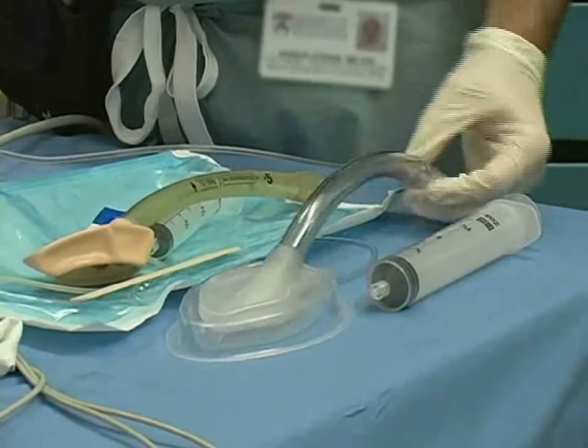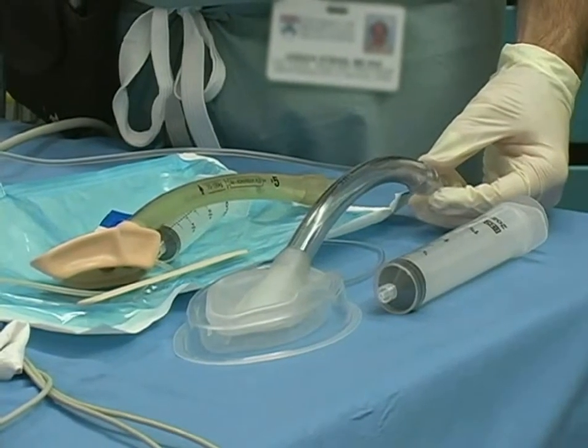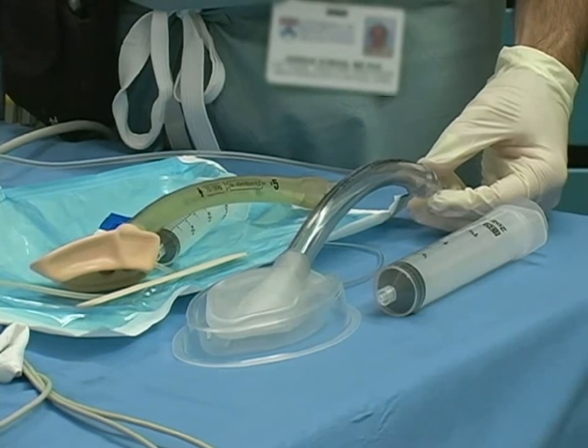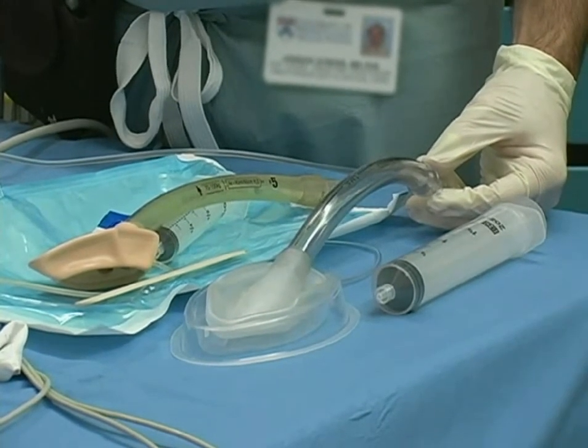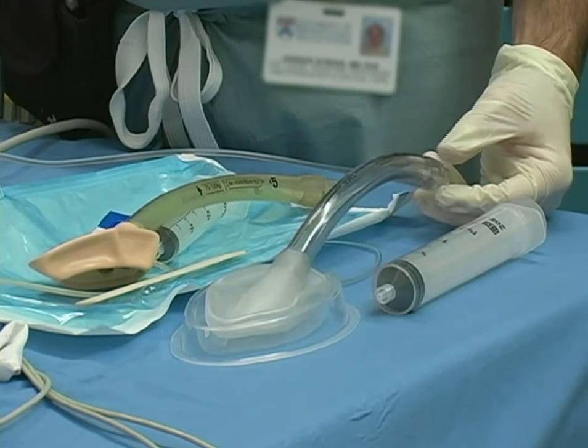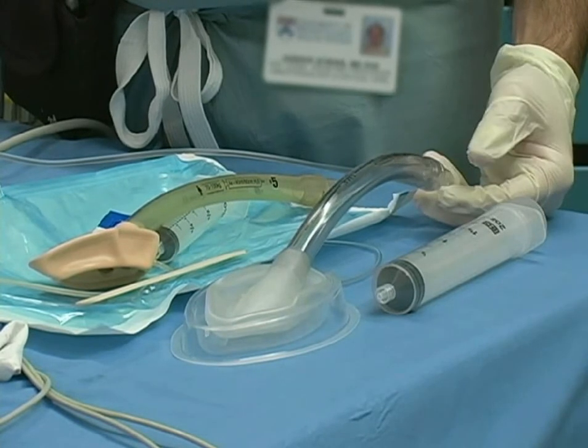Choose the appropriately sized LMA based on the patient's weight, gender, and airway anatomy. Most female adults will need a size 4. Male adults can use a size 4 or a 5. For patients weighing less than 50 kg, the LMA size 3 is suitable.